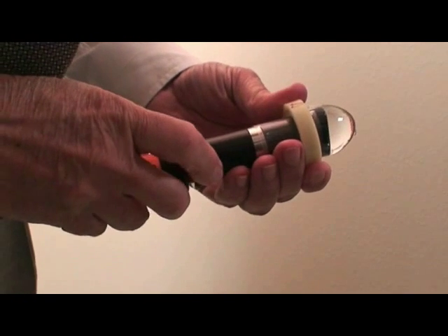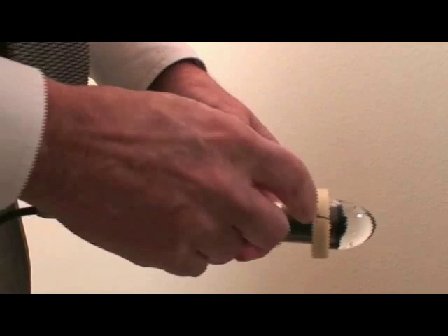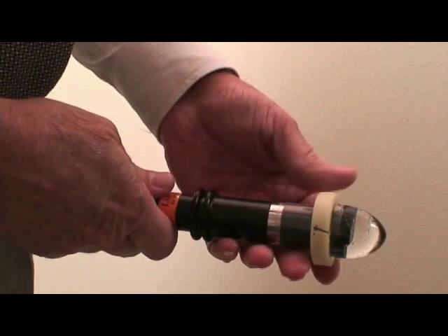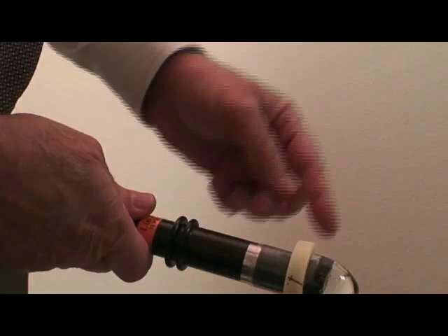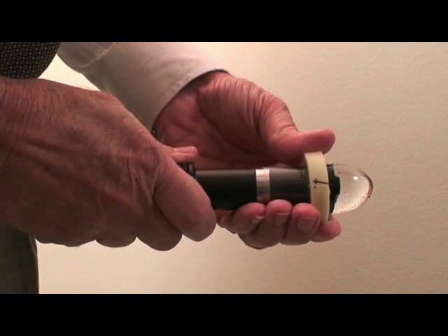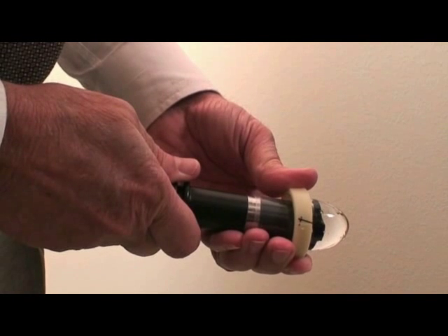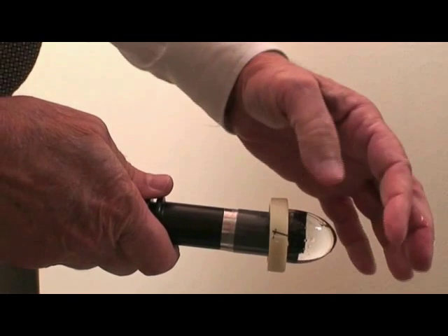Align the white line on the side of the probe with the line on the ClearScan cover. Line marking is not necessary for the newest 50 MHz probe, as the line has been moved upward for easy visualization. It just takes seconds to accomplish the fill and insertion steps. Appropriate bag pressure prevents denting of the cornea — an important point, since not every patient has the same intraocular pressure.